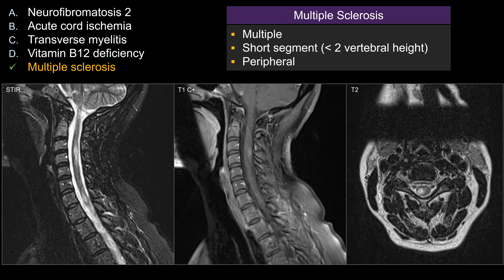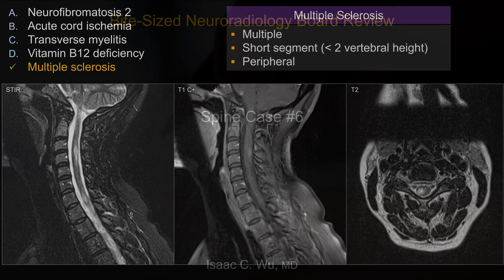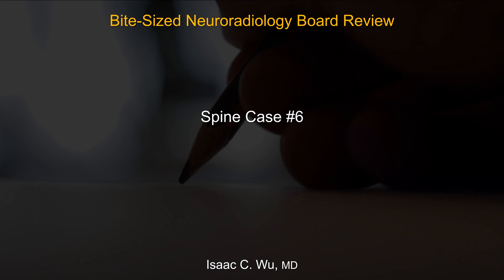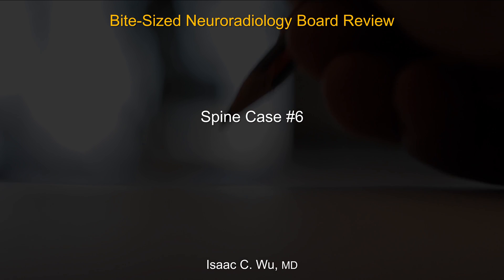As a generalization for multiple sclerosis for board exam purposes, they should show you multiple cord lesions that are short-segmented and peripheral in location. This is a classic example of an MS lesion. That's all for this spine case number six.